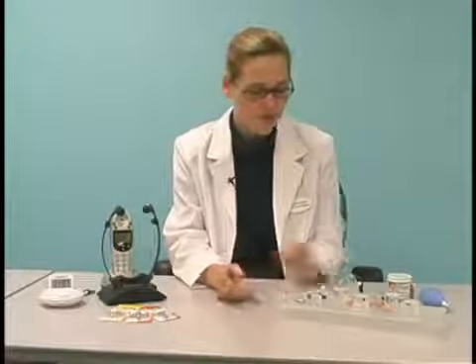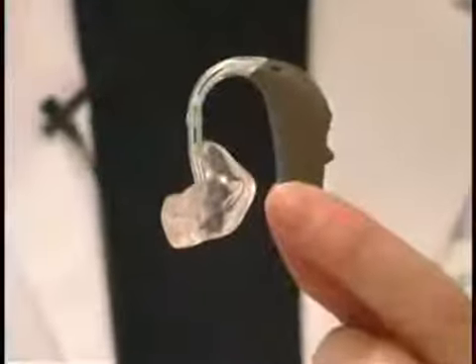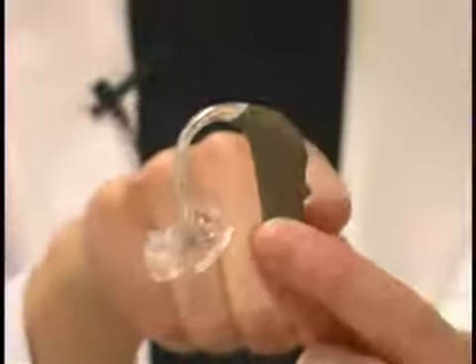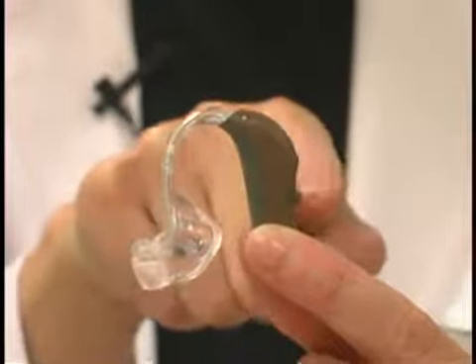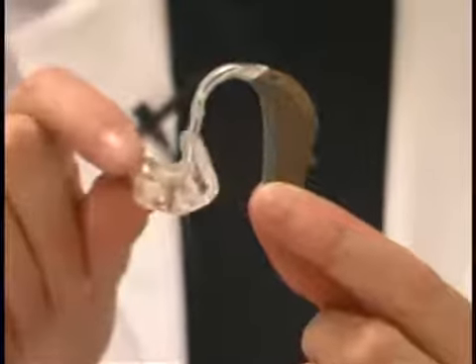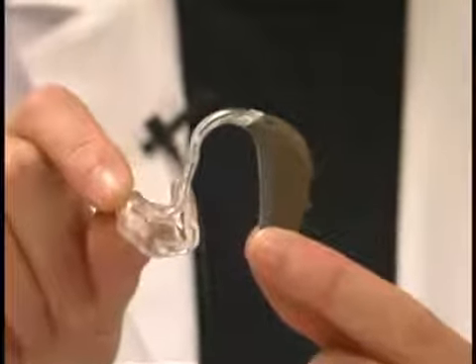Hearing aids have become much smaller and much more compact over the years. It used to be that there was a misconception that if you had what we refer to as a behind-the-ear hearing aid, this is the largest type of hearing aid that's currently available, and it comes with two parts. There's the hearing device, or the case, that houses all of the functional parts of the hearing aid, and then there's what we call the ear mold that goes into the ear. And usually people are quite intimidated when they first see this, because it does look quite large.